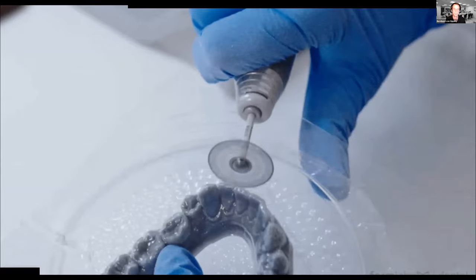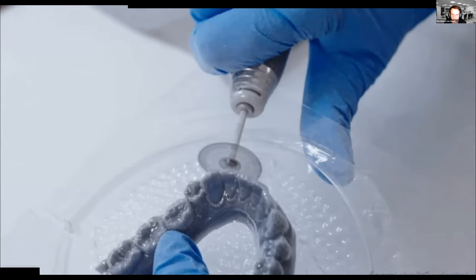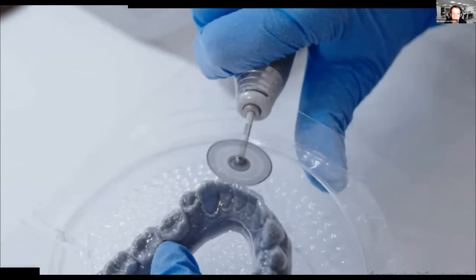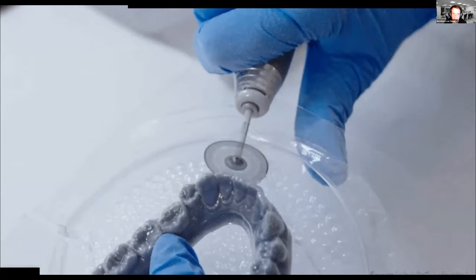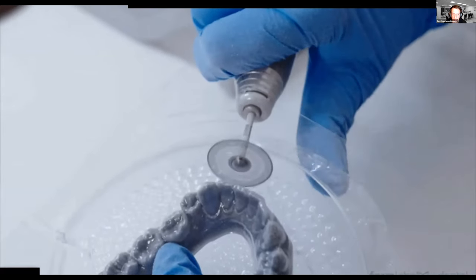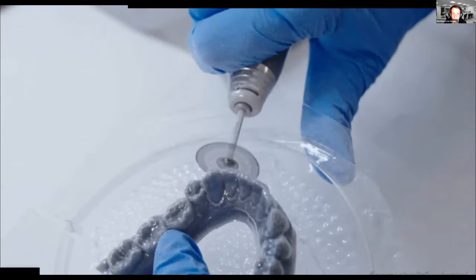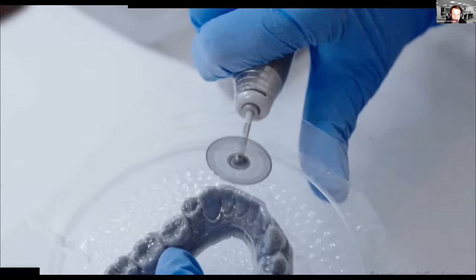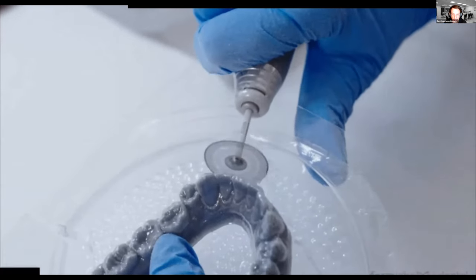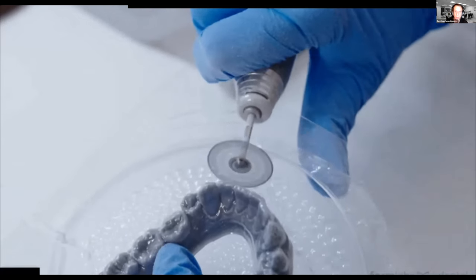So the next step will be, first, you remove the excess material of the sheet you don't need. And you can use a diamond cutting disc for this. And then in the second step, you will try to cut out the aligner to its final dimensions as well as you can. And this can in fact be done while the aligner is still on the model. In this case, you will damage the model, but anyway, you don't need it anymore.